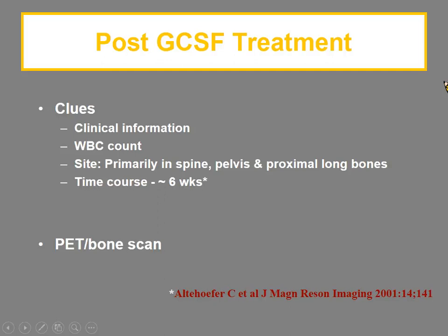The other clue really is the time course to the changes. Because GCSF has a limited span of action, you find that the changes will generally not occur beyond a 6 to 8 weeks lifespan. So if you see changes more than a few weeks after GCSF treatment, it is unlikely to be due to post-GCSF treatment.